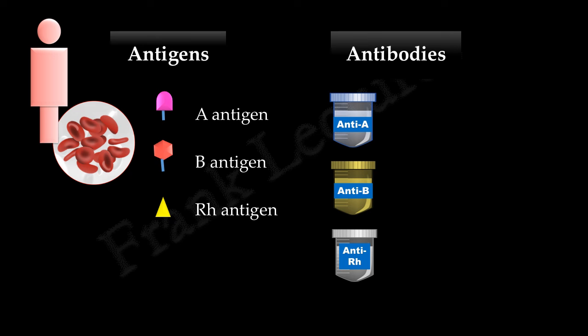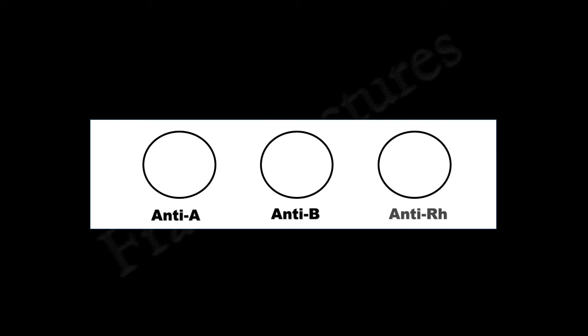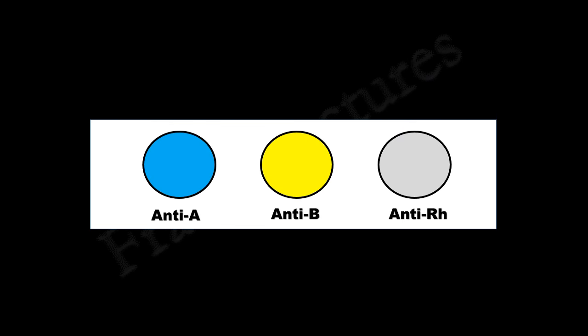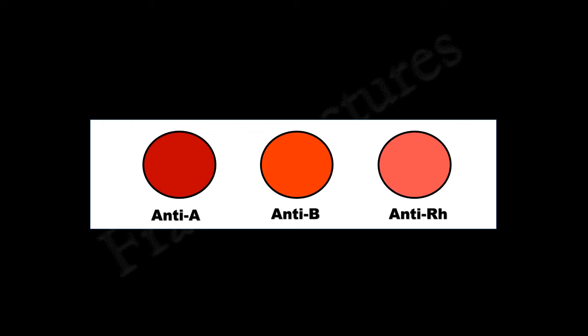Here we have three reagents labeled anti-A, anti-B, and anti-RH. Reagents labeled anti-A contain antibodies against A antigens. Similarly, anti-B reagents contain antibodies against B antigens. Reagents labeled anti-RH contain antibodies against RH antigen. We will take a clean glass slide and mark three circles, labeling them as anti-A, anti-B, and anti-RH. We will put a drop of each reagent in the respective labeled circle, then add one to two drops of blood in each circle and mix the reagent with the blood.